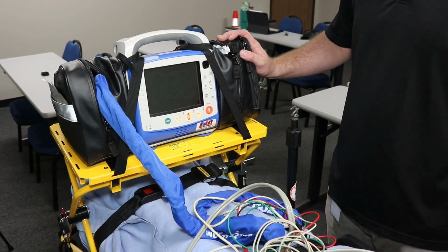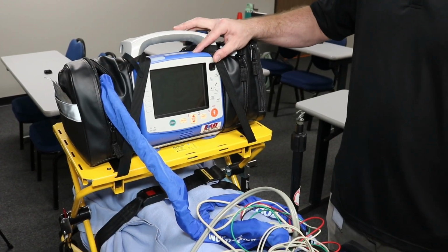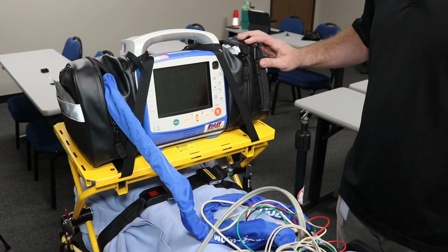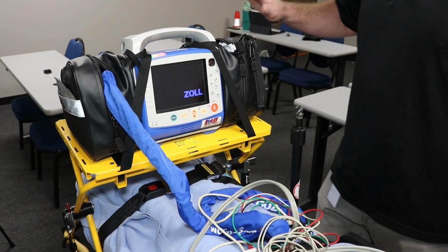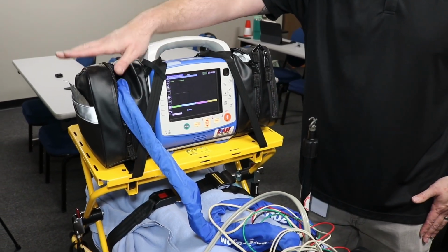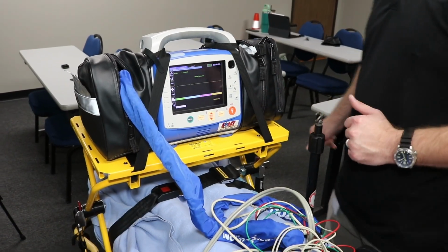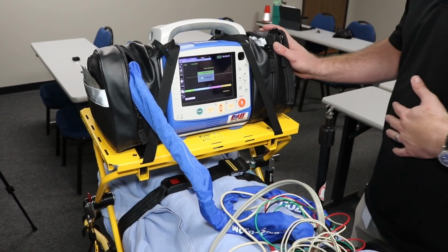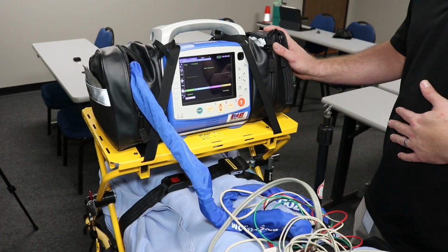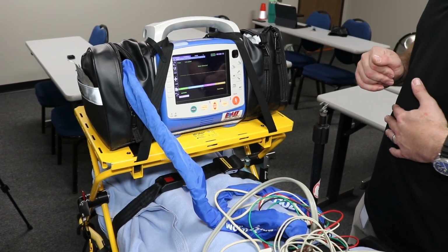Access our defibrillation pads and how to connect that on the monitor. So again, I'm going to turn it on here. The blood pressure cuff, pulse ox, and electrodes are going to be on the left-hand bag looking at the monitor. Our 12 lead cables and our defibrillation pads are going to be accessed on the right-sided bag.